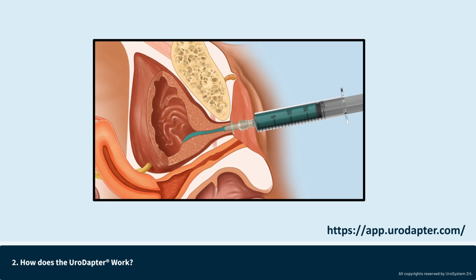During proper instillation, the instilled solution will increase the intraurethral pressure above the sphincter pressure and will completely open the already relaxed sphincter, allowing the solution to easily flow into the bladder. This amount of pressure in the urethra is very similar to the pressure we create during spontaneous urination and doesn't cause any harm, damage, or problem.